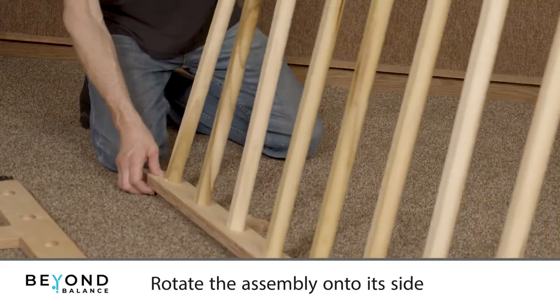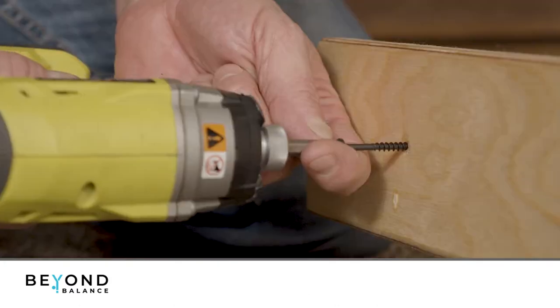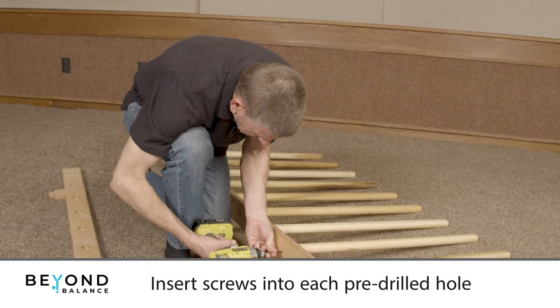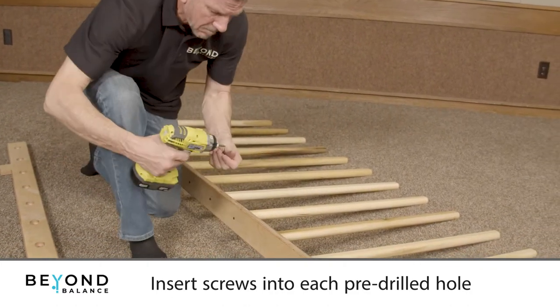Rotate the assembly onto its side and insert screws through the frame and into each dowel, using the pre-drilled holes in the uprights as a guide. Tighten all screws and stand the assembly up.